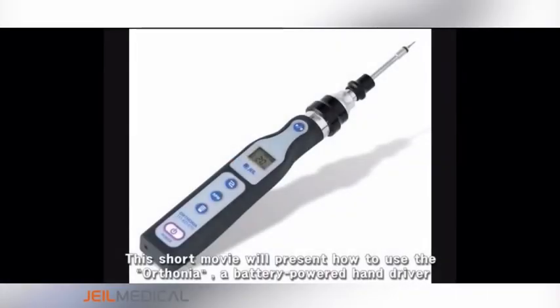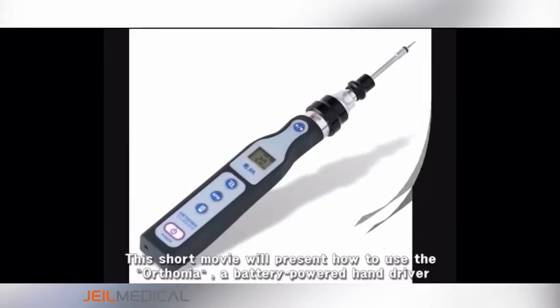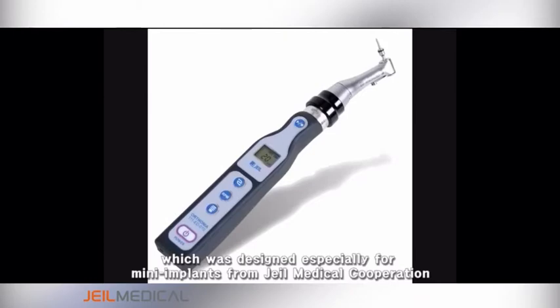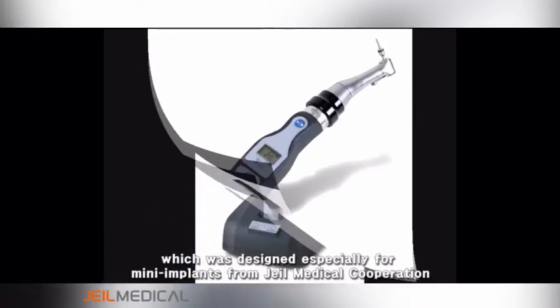This short movie will present how to use the Orthonia, a battery-powered hand driver, which was designed especially for mini implants from Jeil Medical Cooperation.